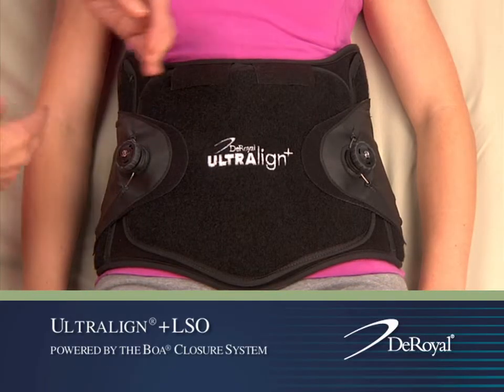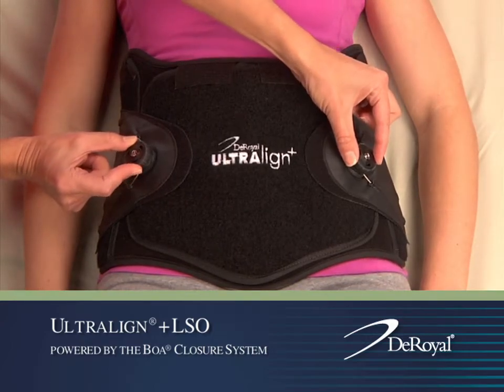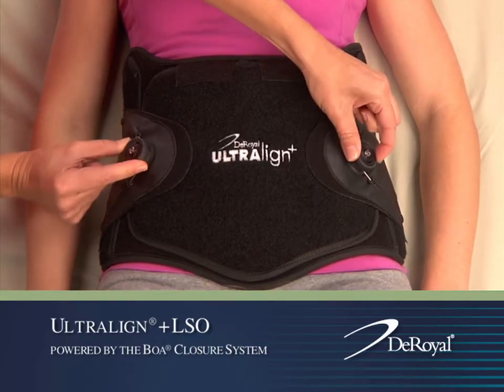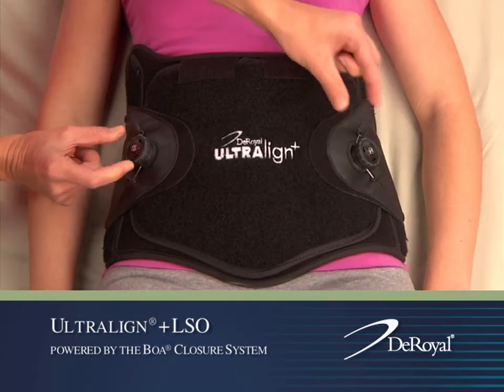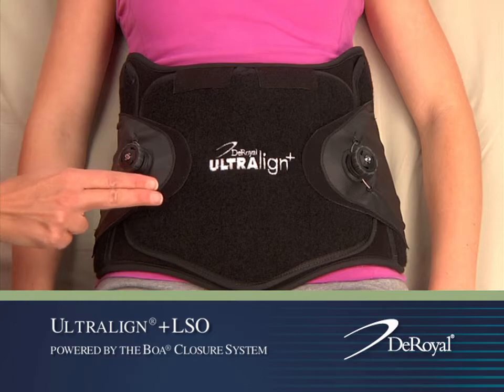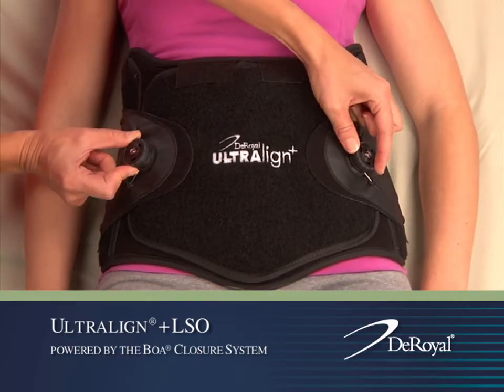On each of the side closure attachments, locate the dial and push in to engage. Turn both dials clockwise to tighten the laces. After ensuring that the anterior panel is in the correct position, you can repeat the tightening process.